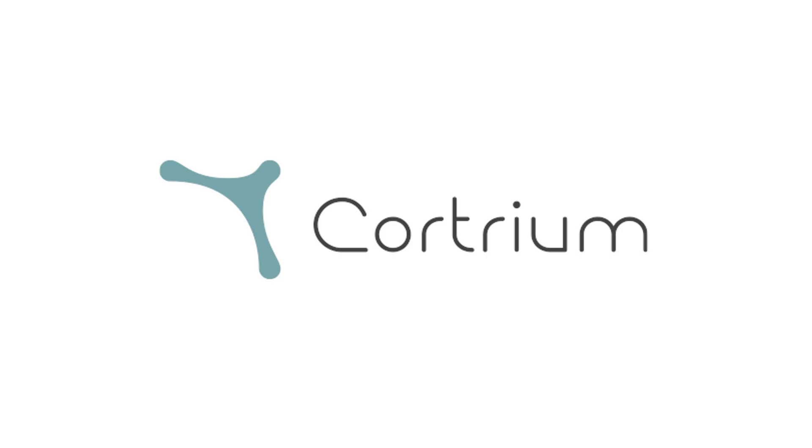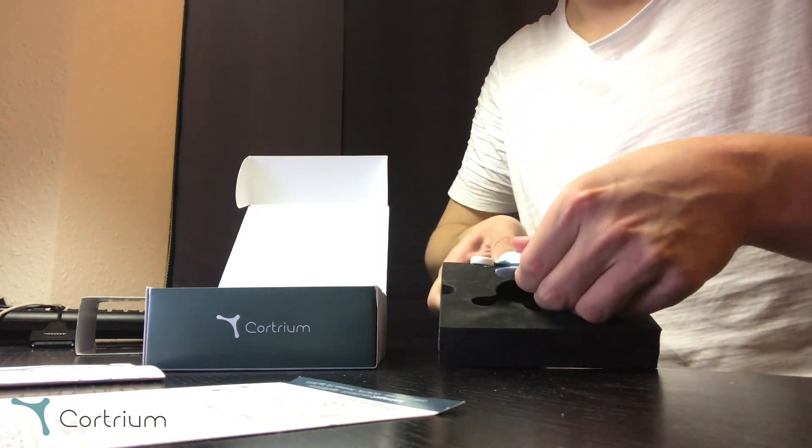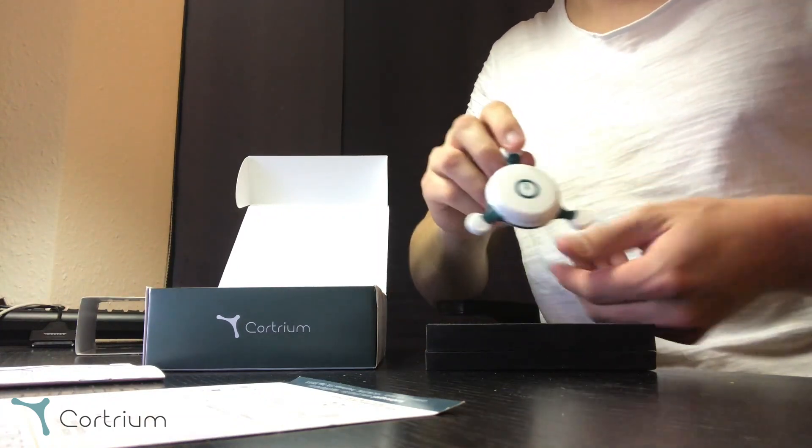Welcome to Cortrium. In this video you will learn how to get started with your C3 Plus Holter monitor. Your package contains a quick start guide, the full technical documentation, the actual device, and a USB cable.